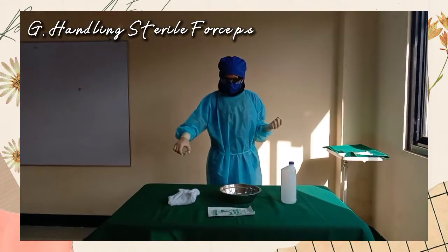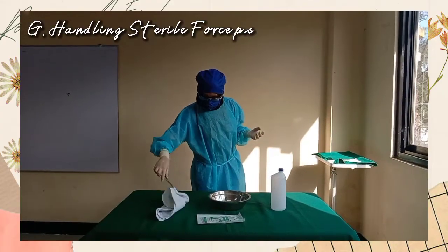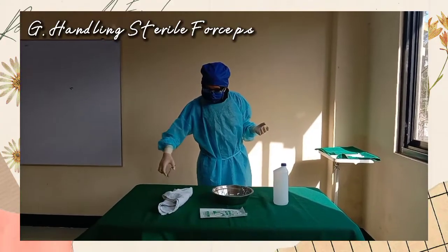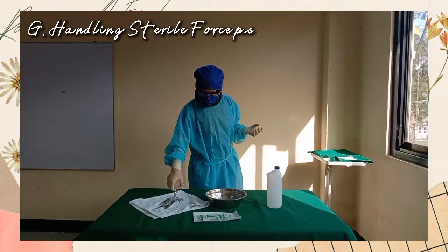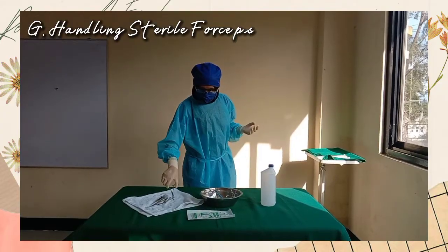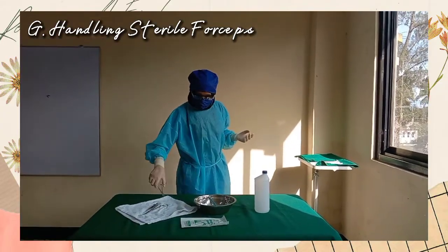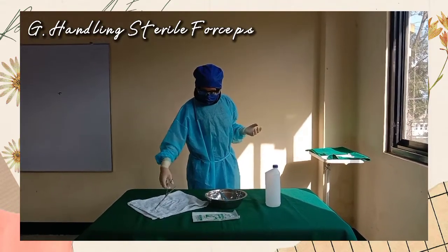When using forceps to lift sterile supplies out of a commercially prepared package, be sure that the forceps do not touch the edges or outside of the package, to maintain sterility. When the handles of the forceps have been in contact with bare hands, position the handles outside the sterile area. The handles harbor microorganisms from the bare hand.